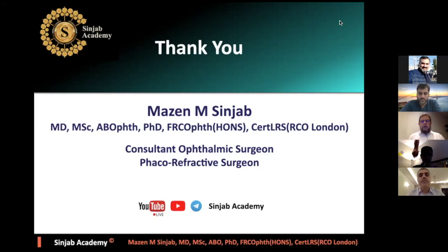Okay, great. Now, actually, of course, it is a very long talk, and it has a lot of controversies, but I'm going to summarize everything, inshallah. The first thing is, we have to know that we are not treating refractive error. We are regularizing the cornea. So we have to concentrate on the coma and high order aberrations, which is the irregular astigmatism.